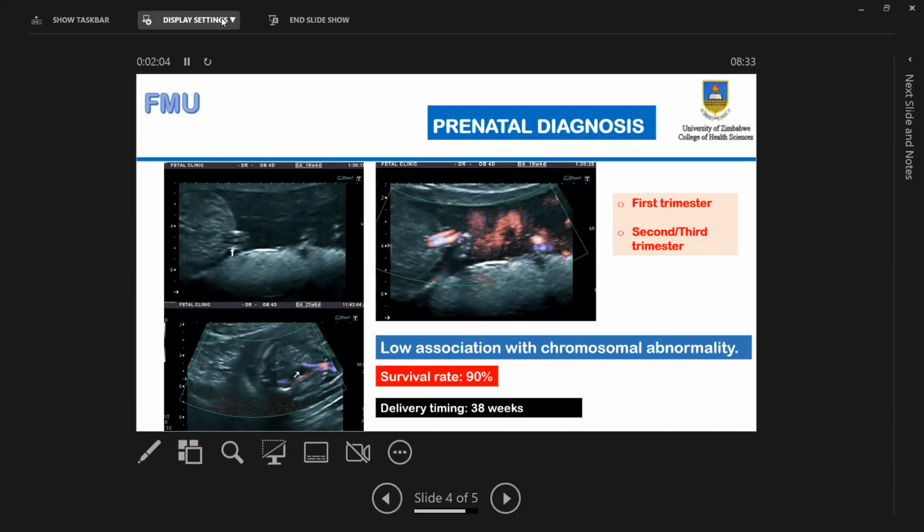It is not just the gastroschisis and the exomphalos we are trying to rule out. We are trying to rule out all the anterior wall defects, because the defects will start at the level of the thorax, going all the way to the bladder area, the suprapubic area there. So all those defects are possible, and they should be screened for using ultrasound.